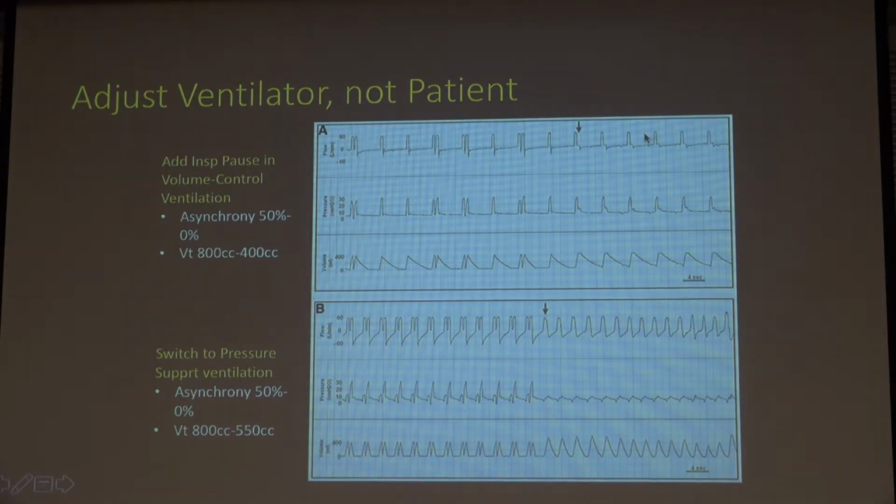Again, this still doesn't make sense to me. That seems very unphysiologic, to take a breath and pause before exhalation. But again, you know, the data is pretty clear that it helped these patients get much more synchronous with the ventilator.